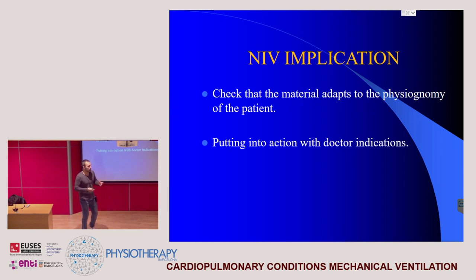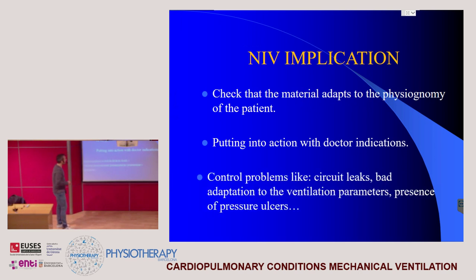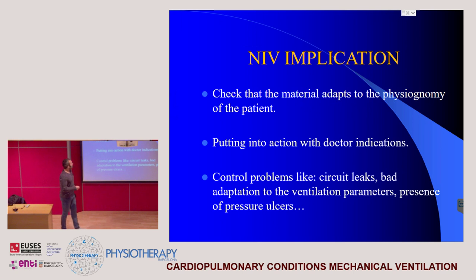and it's something that could be harmful or not adapt to all of the patients. So we have to explain previously, before attaching it, because we have to attach it tightly, to avoid leaks. And finally, as I said, we have to control the problems.